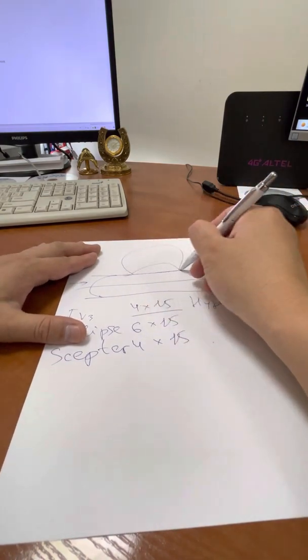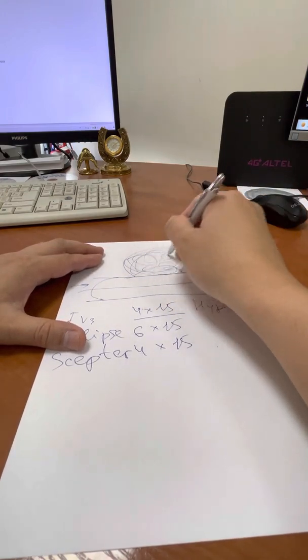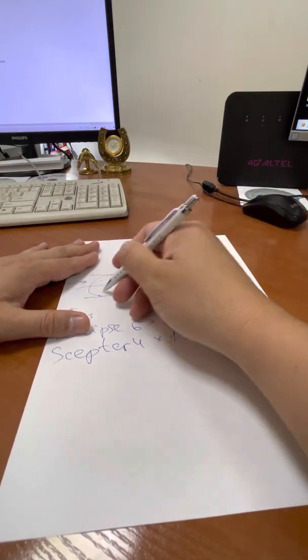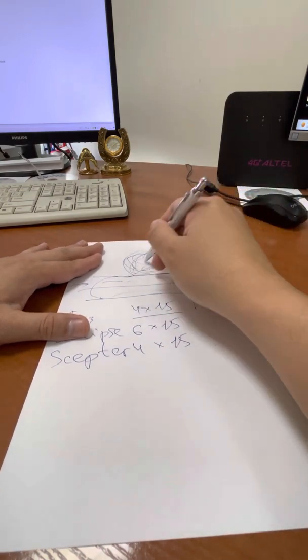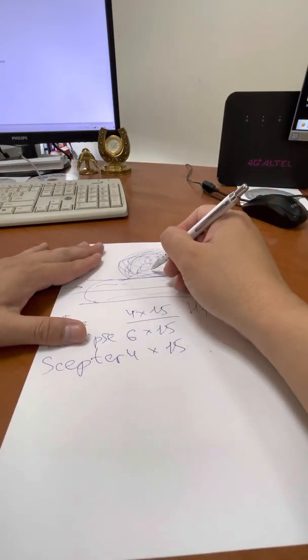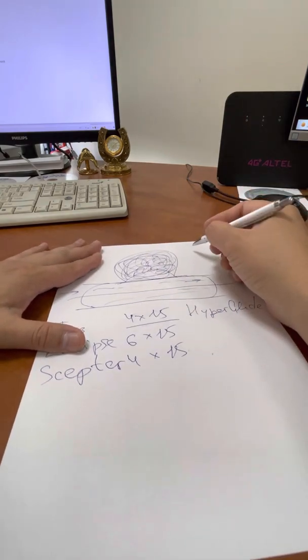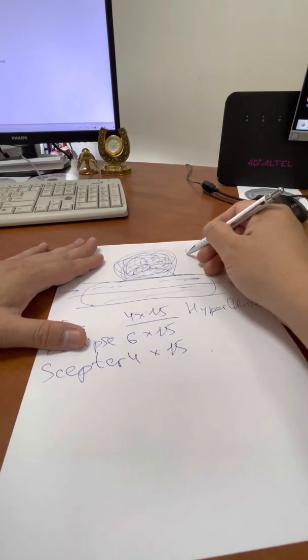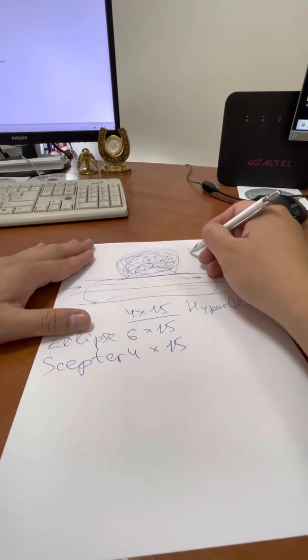That's why I place the balloon, put 1, 2, 3 coils, then if it's needed I deflate the balloon a little bit and see if it's stable or not, and then I place more coils. I try to pack densely, and when there is some need in decision making, I prefer not to put the last coil in an acutely ruptured aneurysm, and in planned cases it's possible I can place the last coil, no problem.